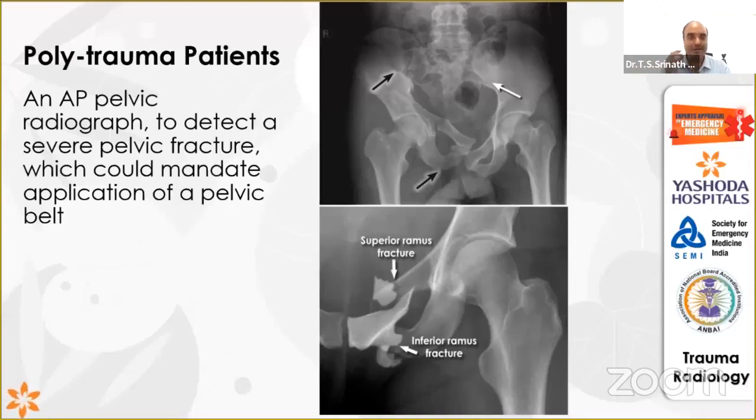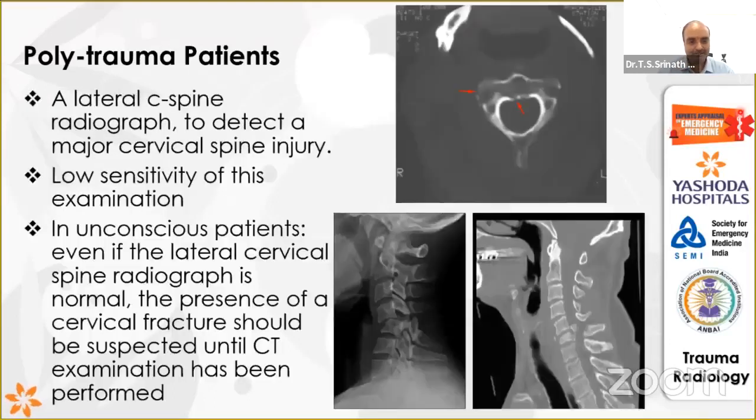So then the next important thing is FAST scan, focused assessment of sonography in trauma. What is the most beneficial thing, and what is the importance of FAST scan in our emergency departments? Of course, we all do e-FAST today. We don't do only FAST anymore, only extended FAST.